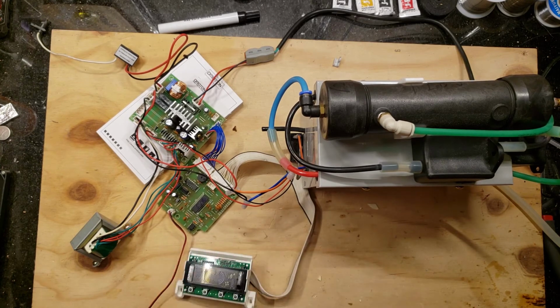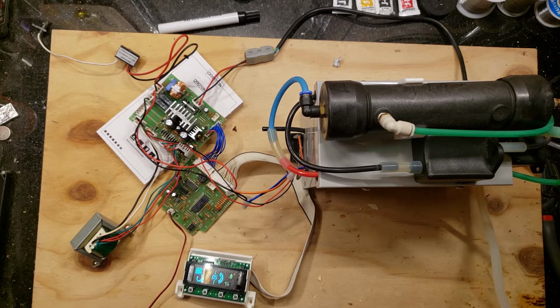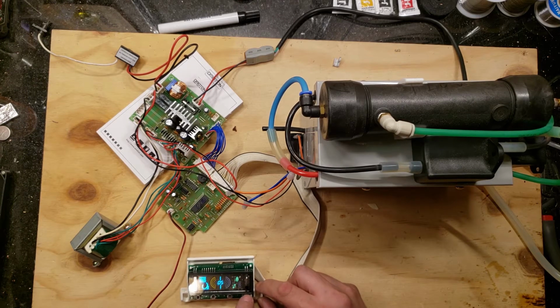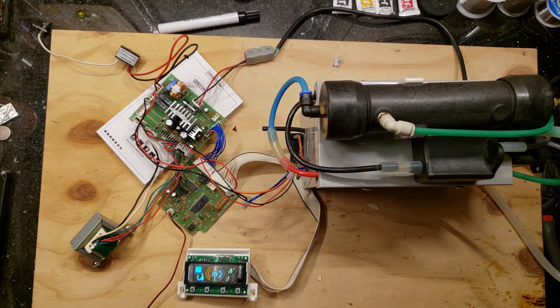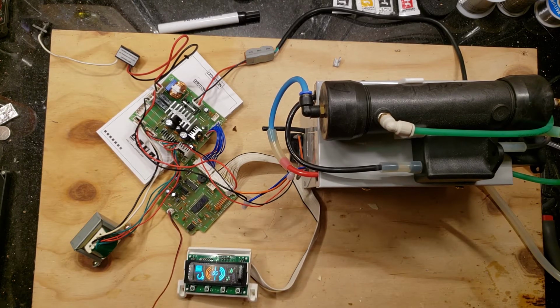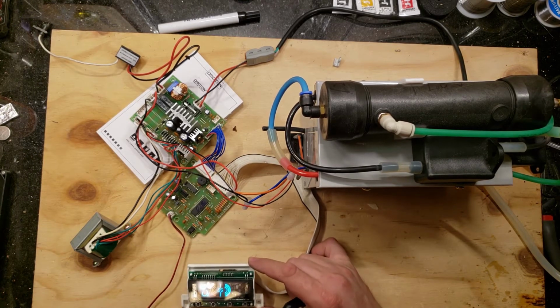All right. Let's see what we got. So, oh no, it just turns on right away. Still does not react to the power button. I wonder how they switched between modes. And still doesn't react to the menu button. Oh, it doesn't react to any button. Interesting. Now it reacts with this open.